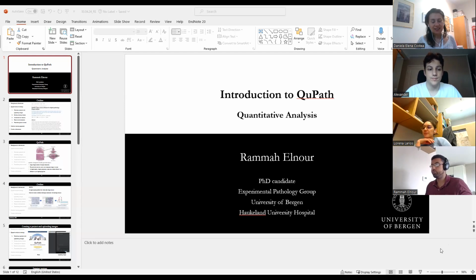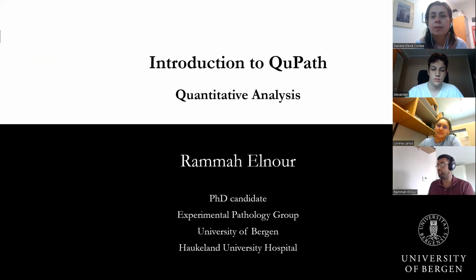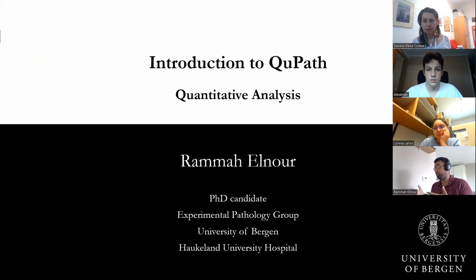Yes. Great. So, sorry, I have a bit of help, but that should be okay. As Dana mentioned, today I'll be walking you through QuPath and how you can use it to get some information out of those TMAs. If you want to look at the number of P53 positive cells, you can use QuPath for those purposes. I'm not going to give you too much background about the software itself, but more a demonstration of how to use it. If you have any questions, please feel free to interrupt me between the presentation.